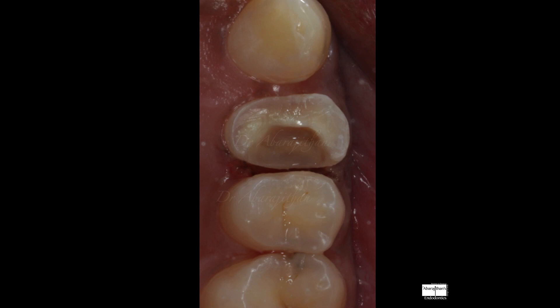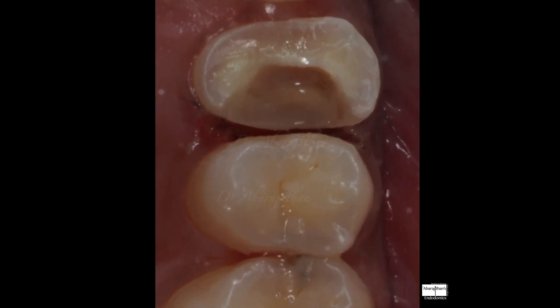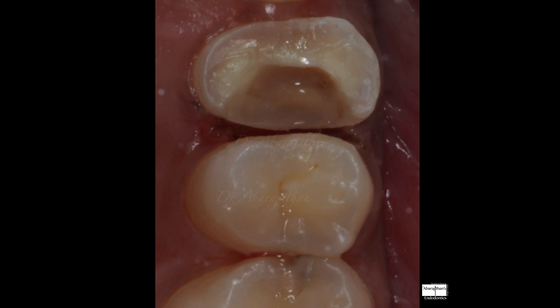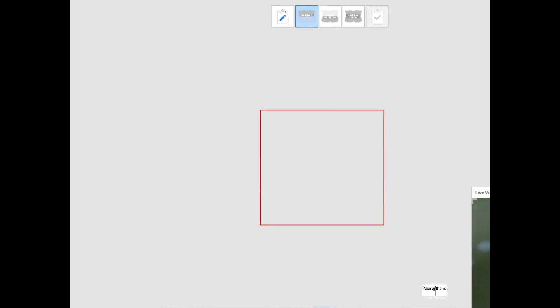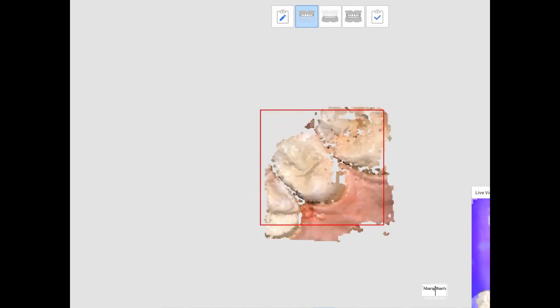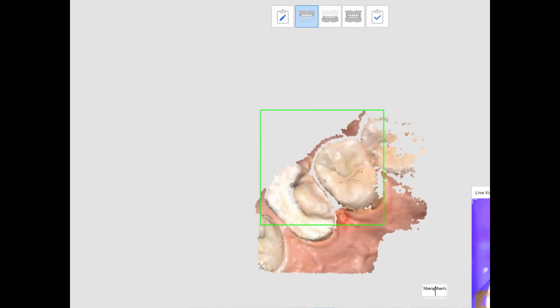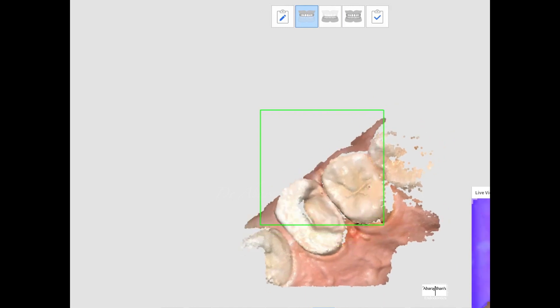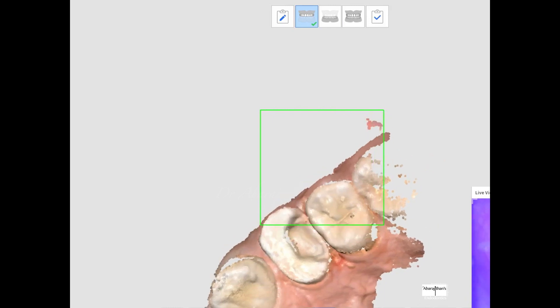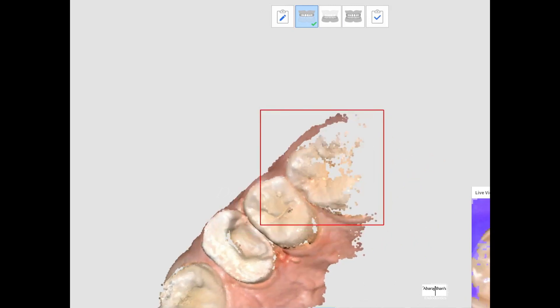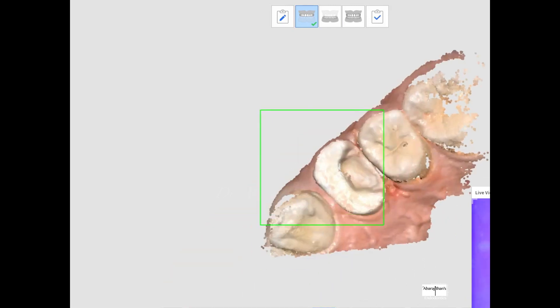After deep margin elevation and after completing my preparation, this is my final prep — you can now see a good supragingival margin compared to the preoperative condition, which is going to give me a much more predictable margin for my restoration. You can see here that my intraoral scanner is able to pick up the supragingival margin much more easily, and the same will apply with impression methods as well.